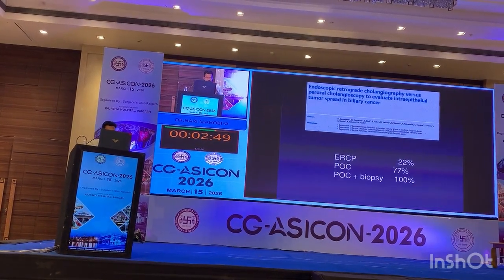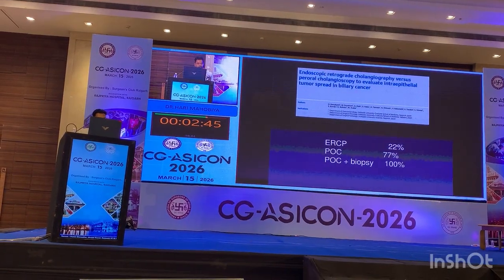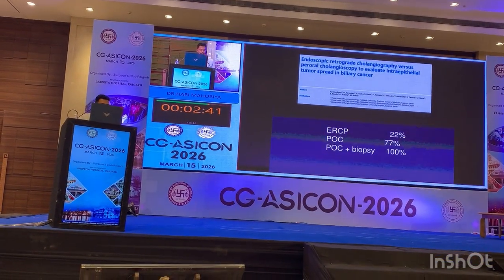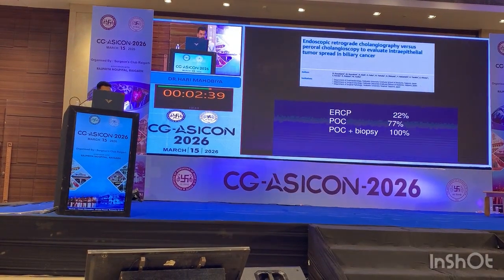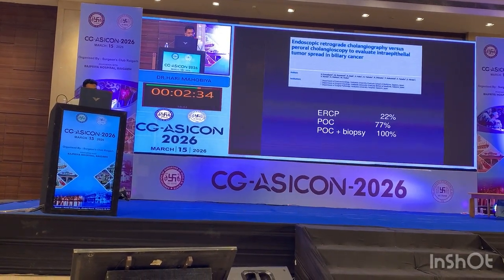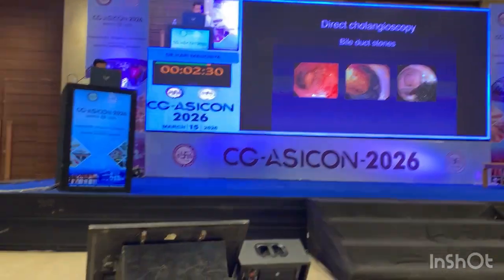This is a paper published from Japan where cholangiography versus peroral cholangioscopy is evaluated for intraepithelial tumor spread in bile duct cancer. ERCP alone is only 22% sensitive. Peroral cholangioscopy alone is 77%, but peroral cholangioscopy with biopsy is almost 100%.